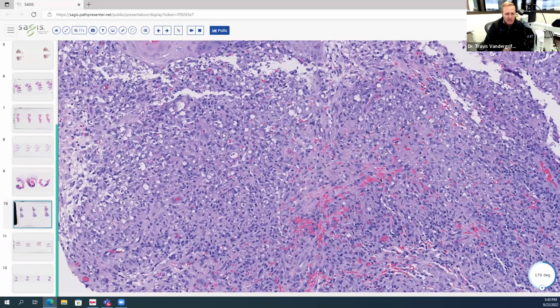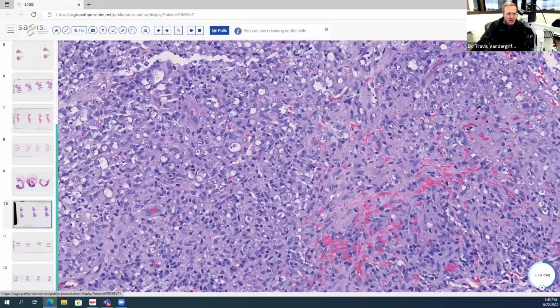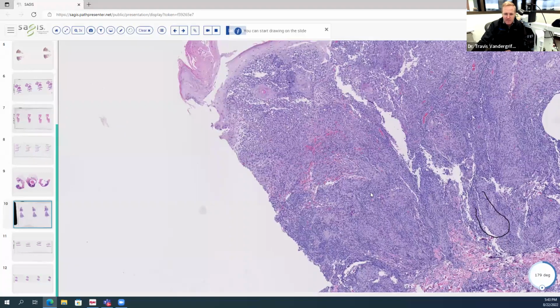Granulomatous basically means that the histiocytes are the predominant inflammatory cell type. And I make that call by saying that the cells here are pale. If it's a lymphocytic inflammation, the cells are going to be dark blue, and on scanning, it's going to make the infiltrate look more dark. I'm seeing a lot of pallor here in these inflammatory cells. So that makes me think granulomatous.